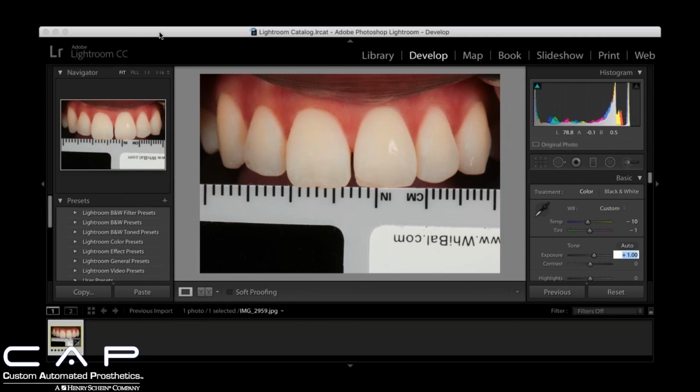And so to get the correct exposure value for a white balanced photo like this, you simply scroll back over to the gray card, and what will happen is when you scroll over the same spot that you clicked on to white balance, the histogram up in the right hand corner will change, and you can set this histogram very easily in your settings to the LAB.